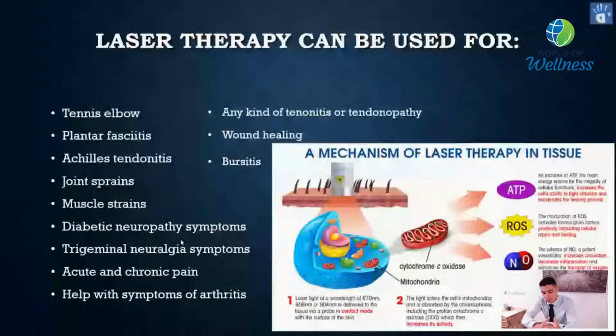So just biomechanics, hopefully your shoulder, instead of being rolled forward, will naturally roll back. And usually how that works is when we treat someone for any kind of rotator cuff tendonitis, we're trying to get the symptoms to centralize. So the pain moves out from the distal extremity up into the actual source, and then it will go away.